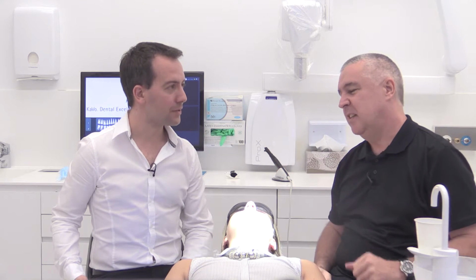And the light transmission through deciduous teeth is actually a little bit different, and I'm not sure whether you've noticed this, because the enamel is more aprismatic and less well mineralized. It's also a lot thinner. So you notice that when you look at these teeth, how thin and delicate they are compared to permanent teeth. But it certainly can be used in deciduous teeth really well, and I often find that adults may not really worry so much about radiographs, but often it's parents of children who are just a lot about the kids. Yeah, yes. Well, you know, a growing person, and yes.